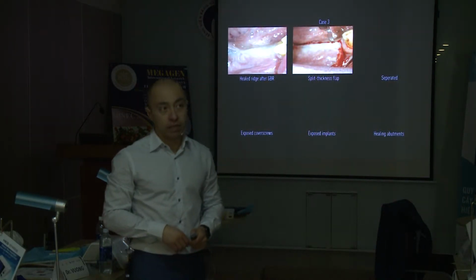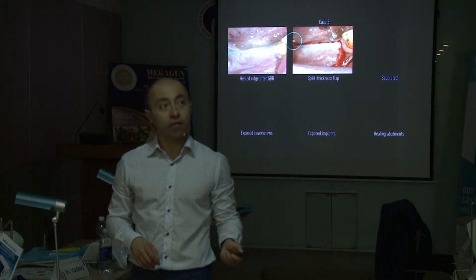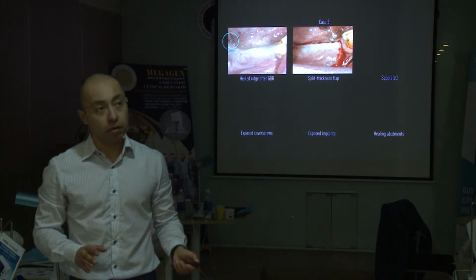So here we have a case, healed after GBR, so the implants are all already in.